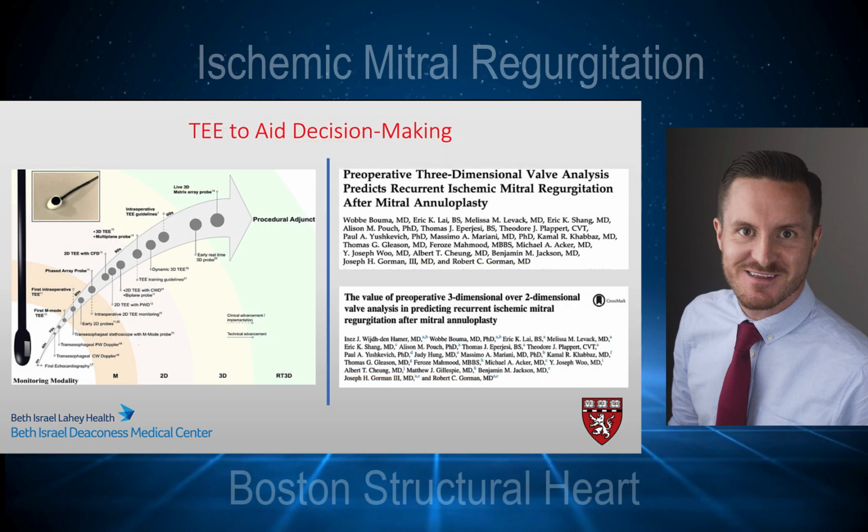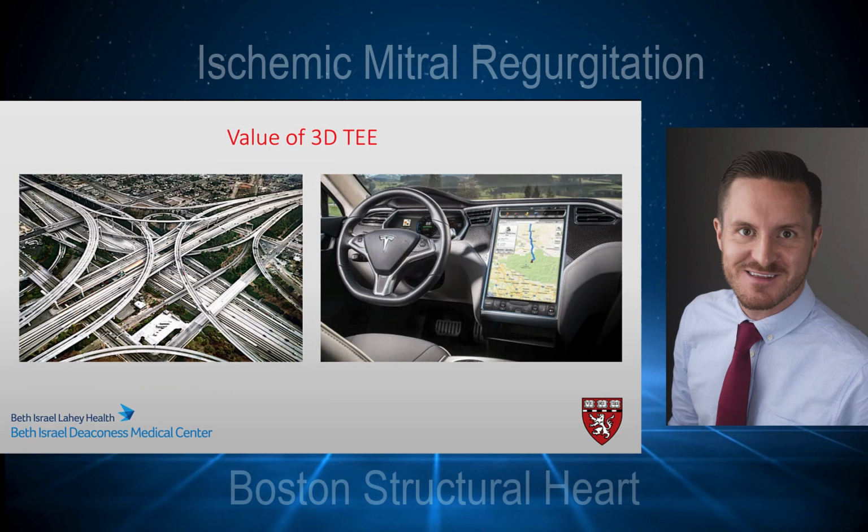This is where we as cardiac anesthesiologists play an important role in the decision-making process. Transesophageal echocardiography, and more specifically, 3-dimensional transesophageal echocardiography, plays an integral role in guiding therapy and in the decision-making process. The value of 3D echocardiography is that it has the ability to assist us in navigating through complex decision-making with regards to mitral valve interventions and providing a roadmap for mitral valve repair.